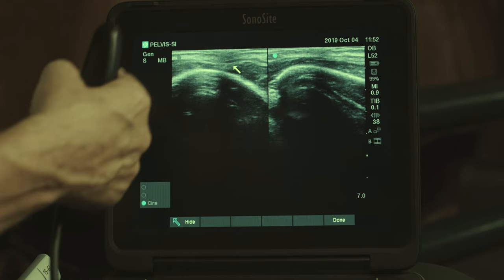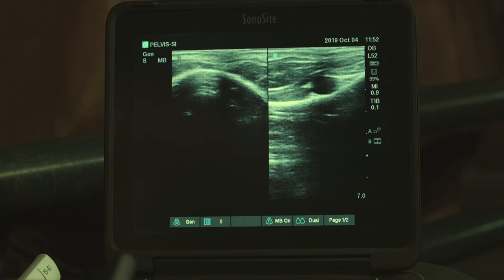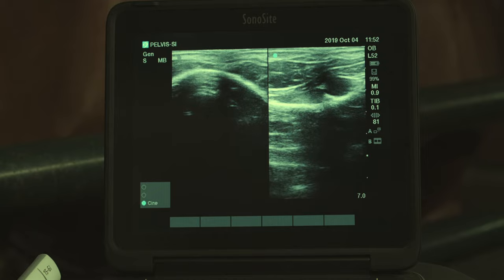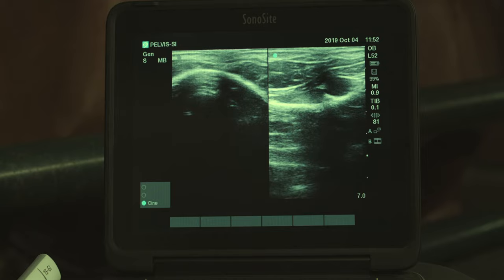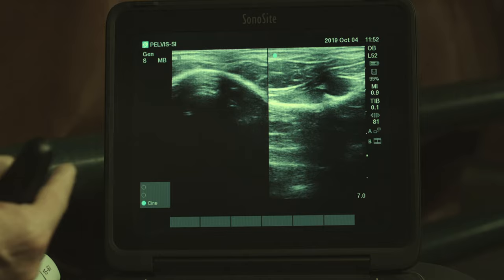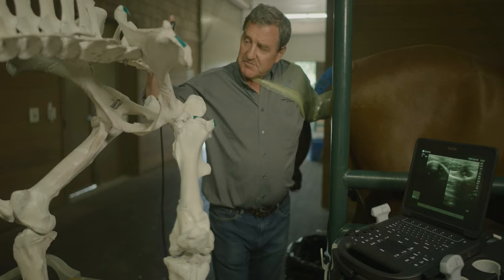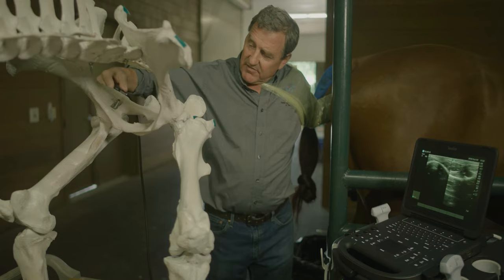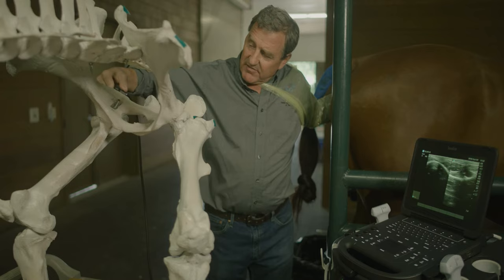Again, right on the right and left on the left. Moving forward from there, we're going to do the inner portion of the acetabulum. You have landmarks here that are vessels — the obturator vessels that form these circles here and here. They're the obturator artery and vein, and you get a W-shape to the acetabulum. On the specimen you can see as I move my transducer up, this is the back side of the acetabulum. You can't see into the hip joint, but you can see the acetabulum from the back.